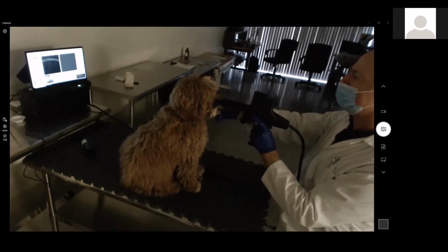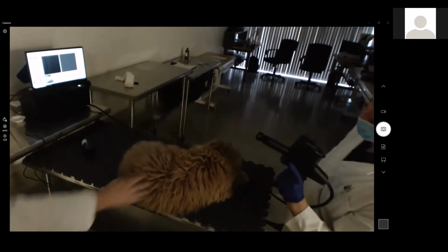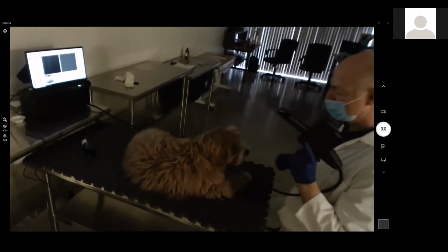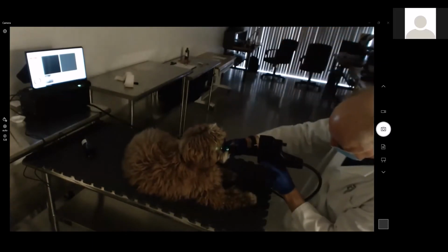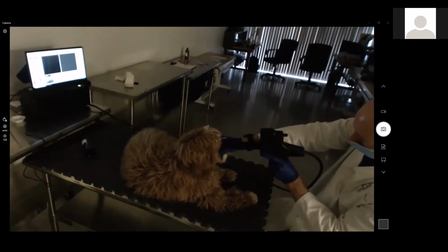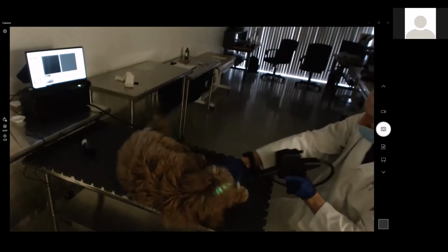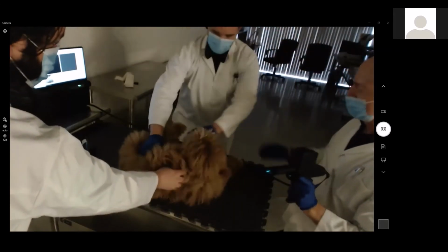There is the iris. Good boy. All right, see how fast he loses his attention? This is always a fun part of working with awake animals. Okay, come here. Come up. Good boy. I need somebody to put hands on him, please. Sorry, I don't want him to roll off the table. I can't hold on to his muzzle.